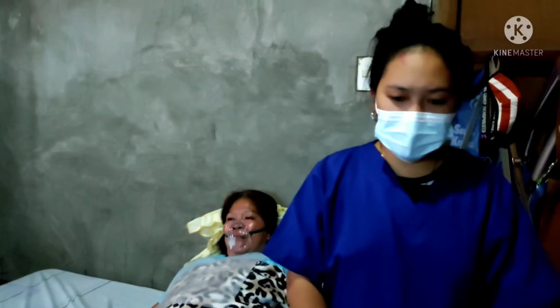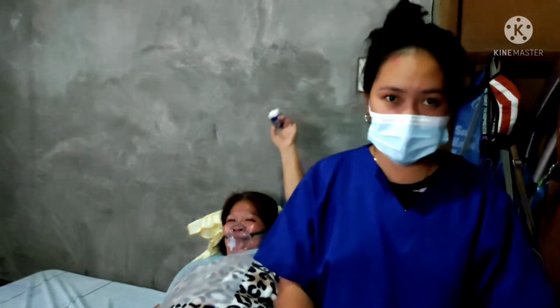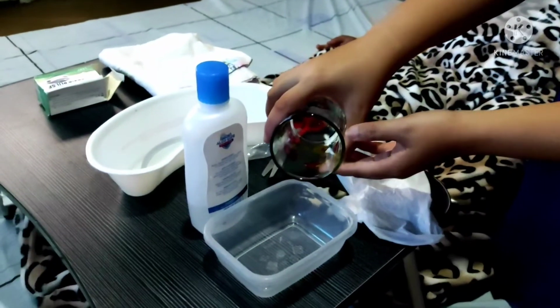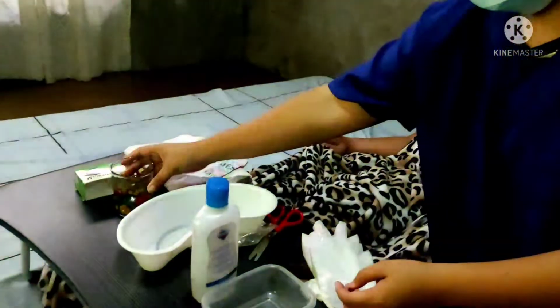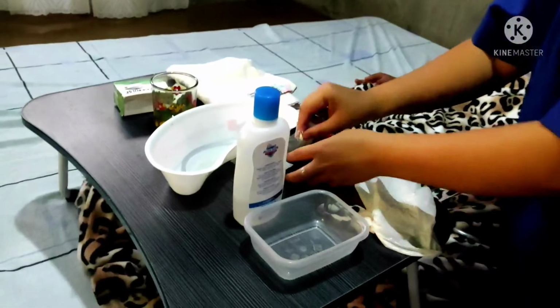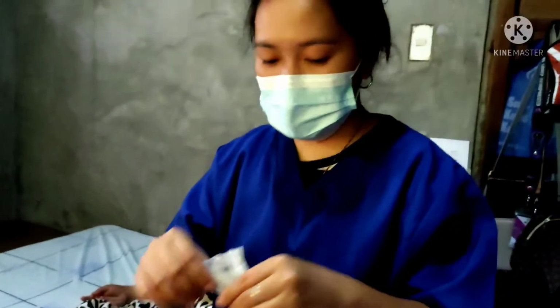Fill the tray compartment with about 100 ml of sterile normal saline solution or sterile water. So let's assume that this is sterile water. So we put it here in the compartment. Open the water-soluble lubricant and squeeze it onto the open sterile catheter package. So let's assume that this is a lubricant.